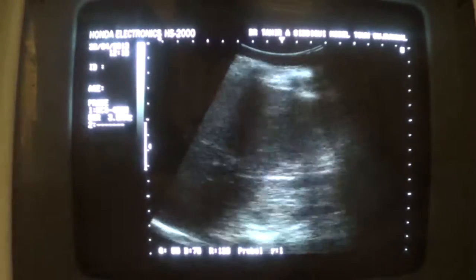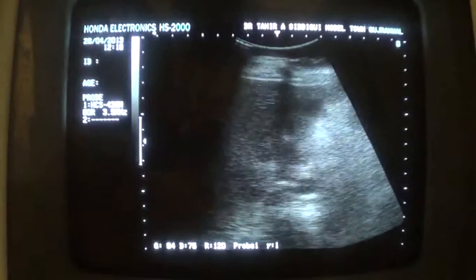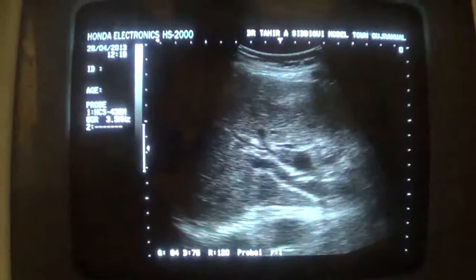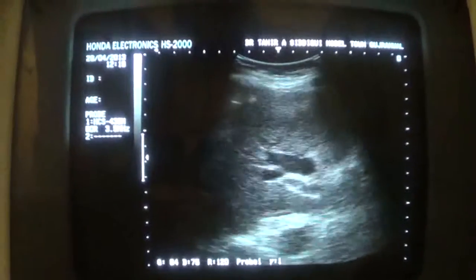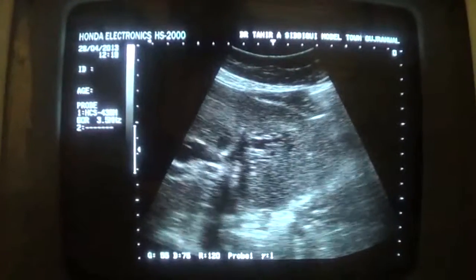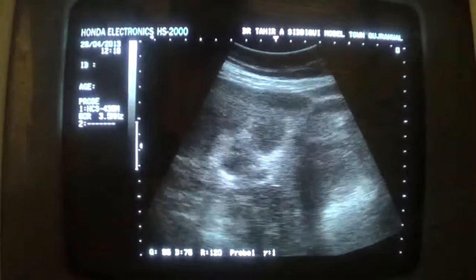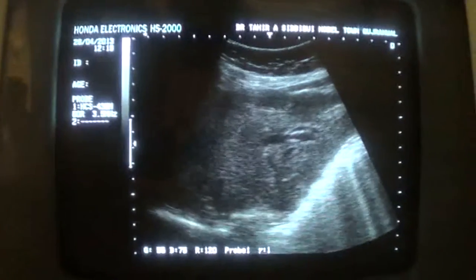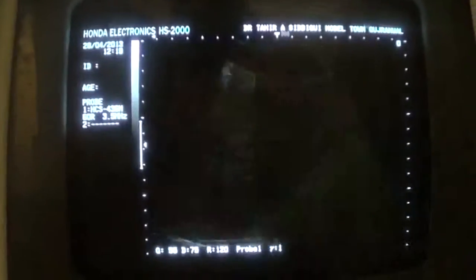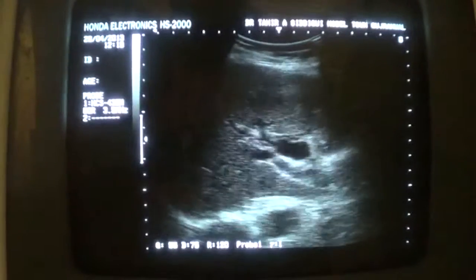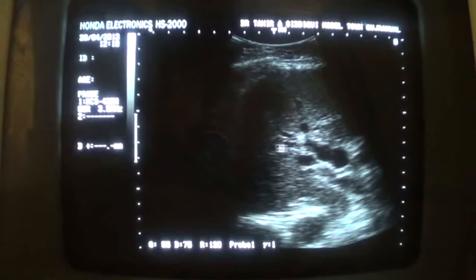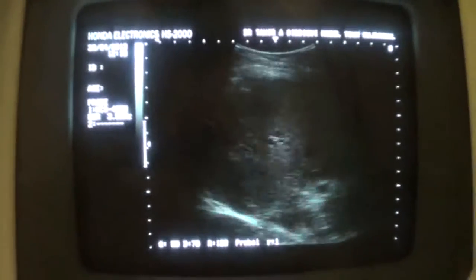Asking the patient to turn towards his left lateral decubitus. Now this is the scan in left lateral decubitus. You can see that the liver is normal in texture. The outer surface of the kidney is normal. And here you see the dilated intrahepatic bile ducts. So the bile ducts are dilated. Here you see the bile ducts are dilated, but they are not dilated excessively.